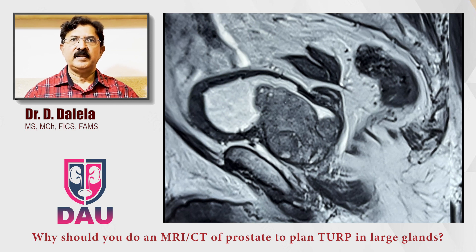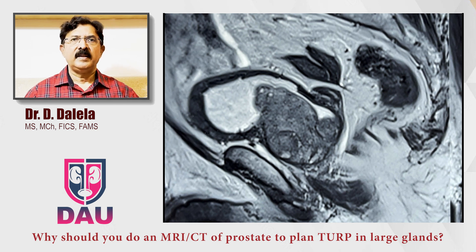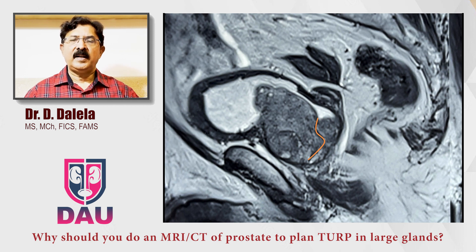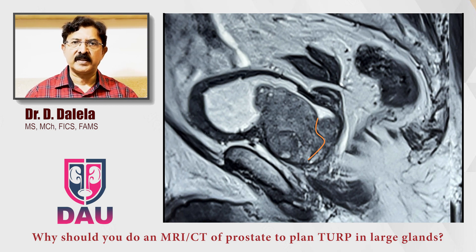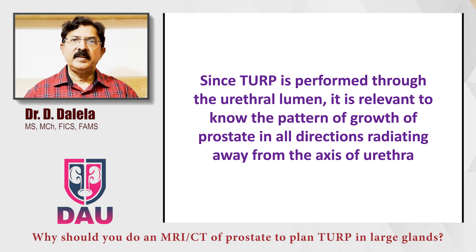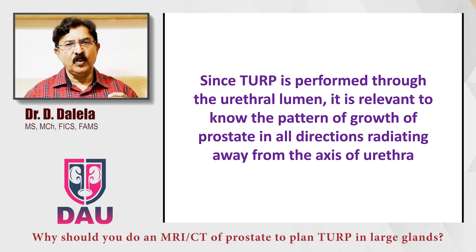In another patient, in a sagittal view, you will see the prostate has grown significantly inside the urinary bladder. When we approached the radiologist trying to find out where the urethra is, they indicated its course. Now you can see that more than 80% of the prostate volume is located anterior to the urethra, not posterior to it. So if you were to do a transurethral resection of this patient, you can anticipate the technical difficulties that you will face. Since the operation of TURP is performed through the urethral lumen, the resectionist has to know the distribution of prostatic tissue in reference to the urethra.